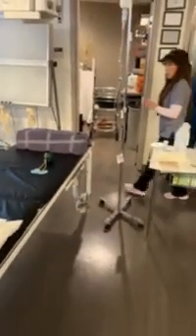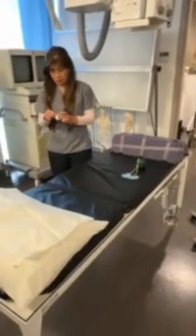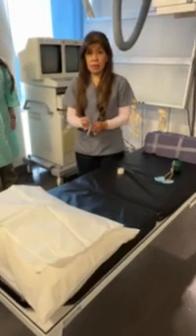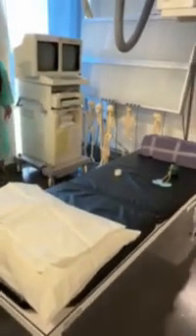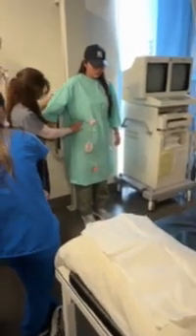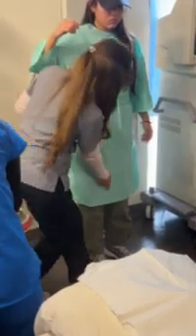Because remember, you always have to label your images and put the marker. How important are the markers nowadays, guys? So important, right? Doesn't drive you crazy. Okay, so I'm gonna find the iliac crest, which is pretty much where she's at right now.